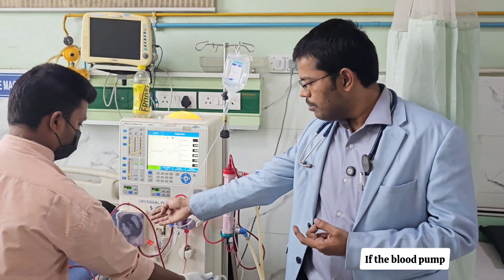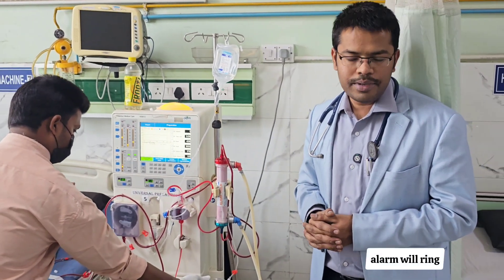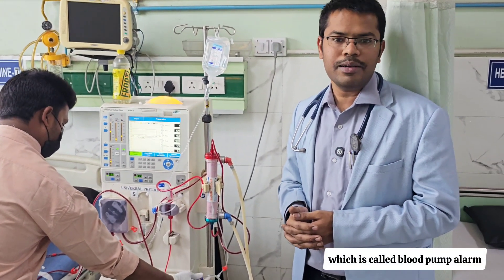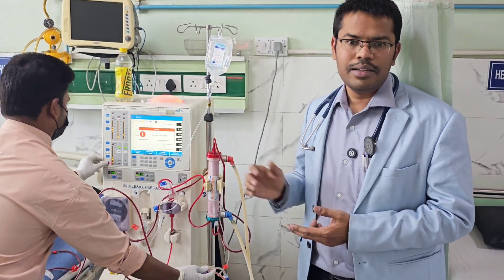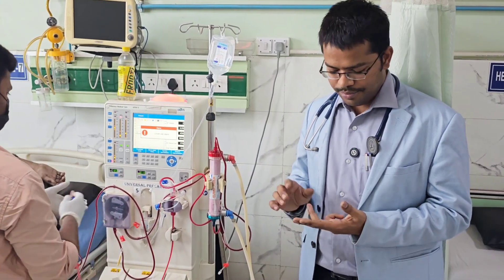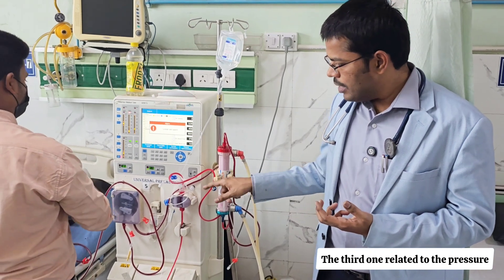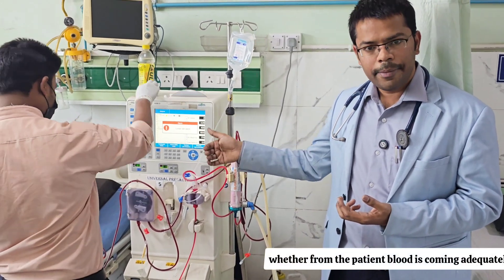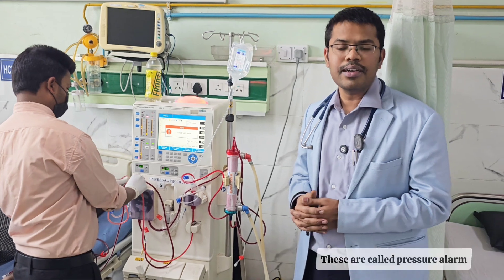The second blood circuit alarm is the blood pump alarm. If the blood pump cover is opened for any reason, the blood pump alarm will ring. The third type is the pressure alarm — these monitor whether blood is coming adequately from the patient, indicating whether the vascular access is functioning properly.